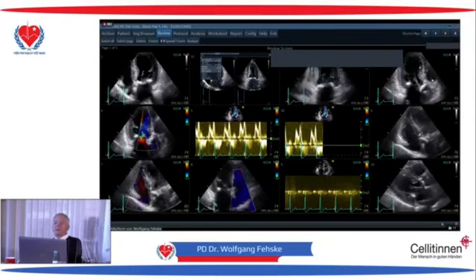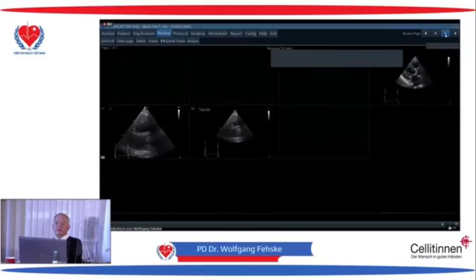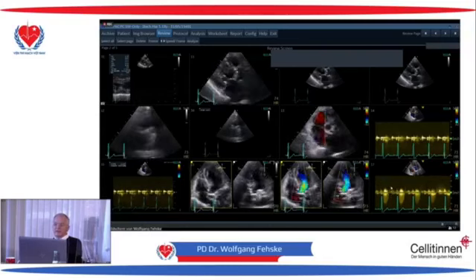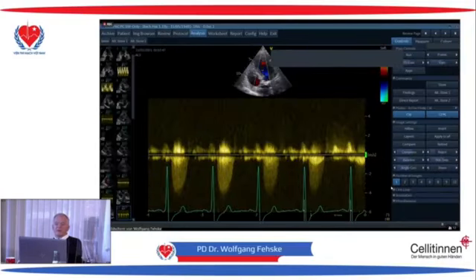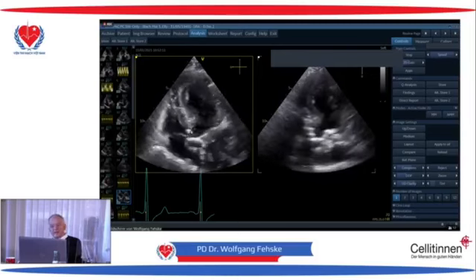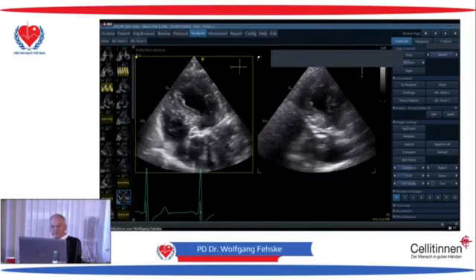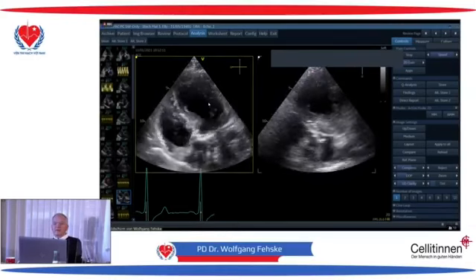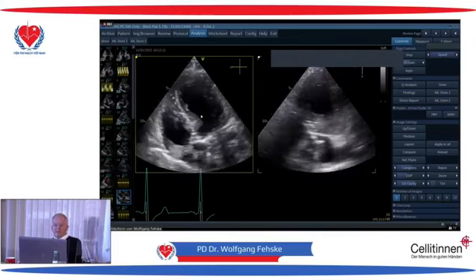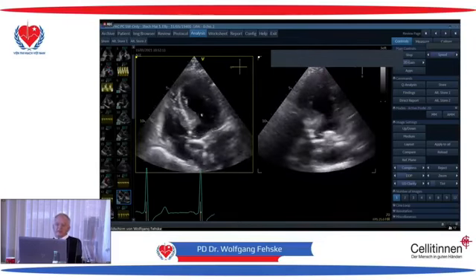You know the problem, so we just do the diagnosis because this would be the easiest to discuss any other things afterwards. You see how I do it. I scan just a minute before, I should show you, this is a steep angle. This is typical for aortic stenosis, older women, small hearts, hypertensive heart disease, and there is a steep angle in this direction.